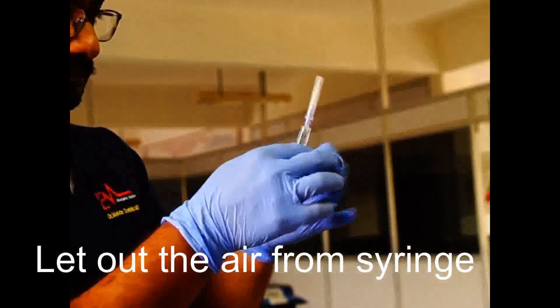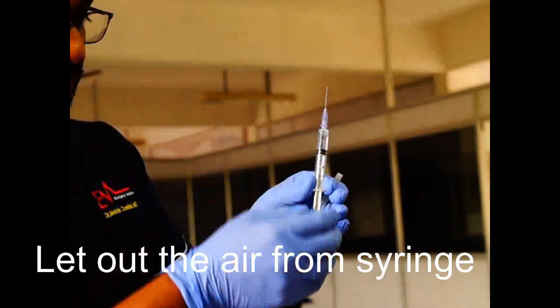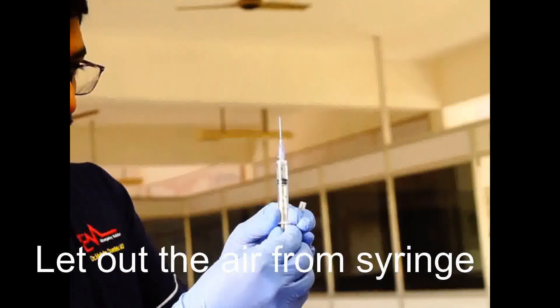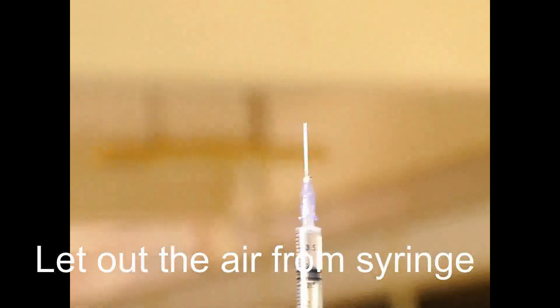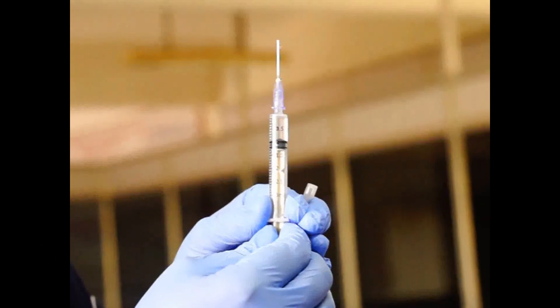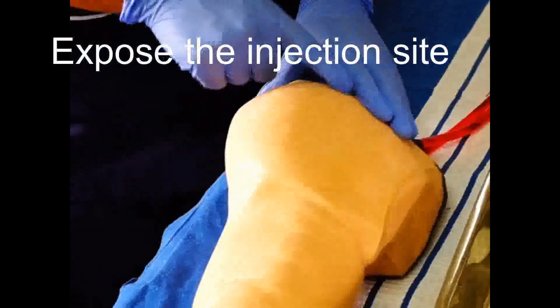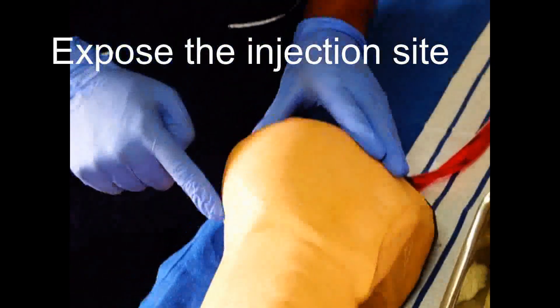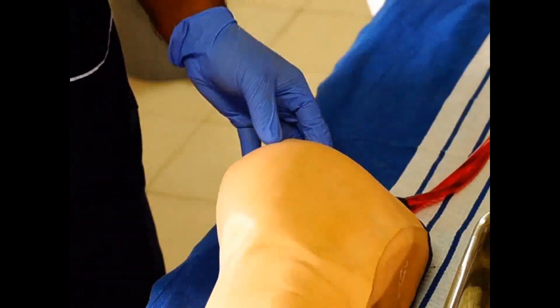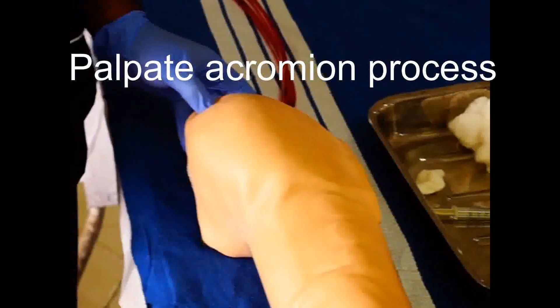Gently tap the syringe and let out the air until you see the medicine at the tip of the needle. Now expose the injection site. For a deltoid injection, palpate the acromion process to identify the correct location.